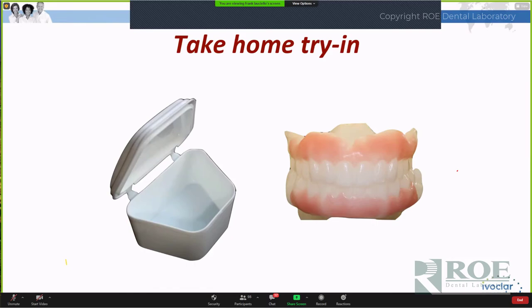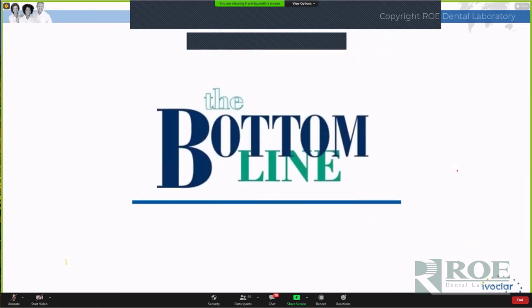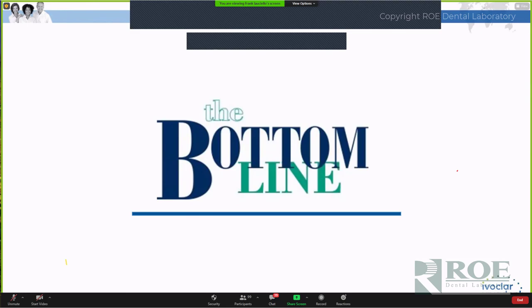Now, let's say you had to make a lot of changes. What should you do? Do another try-in. If you've got a very challenging patient, maybe you have to do multiple try-ins. Charge for it, I think. But certainly, why go to the final denture until you're confident that you can achieve all that the patient is asking for? So multiple try-ins might be an opportunity for you.